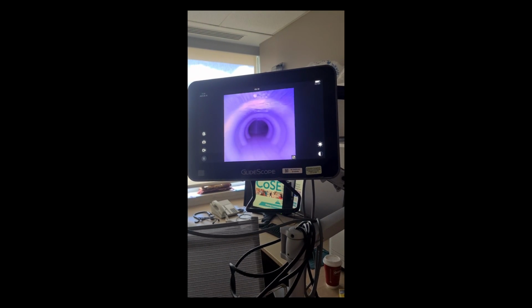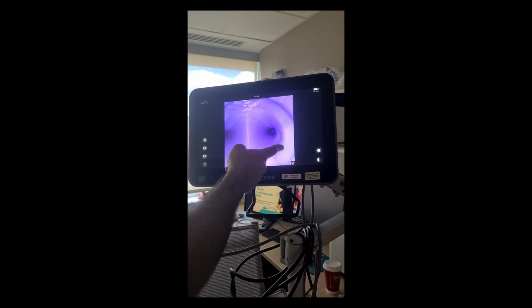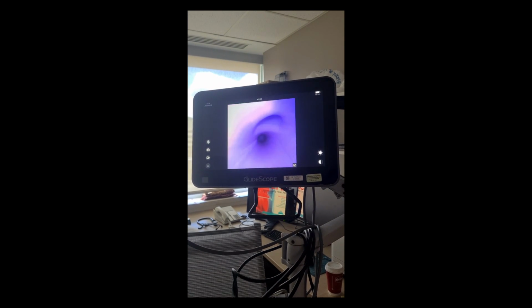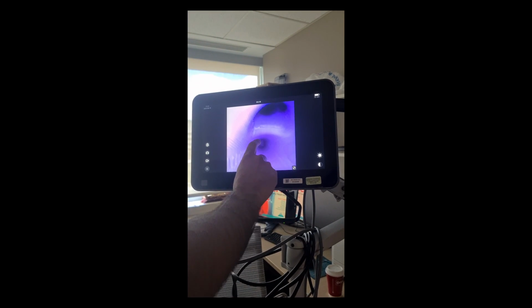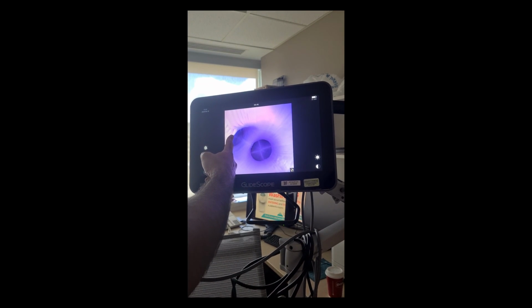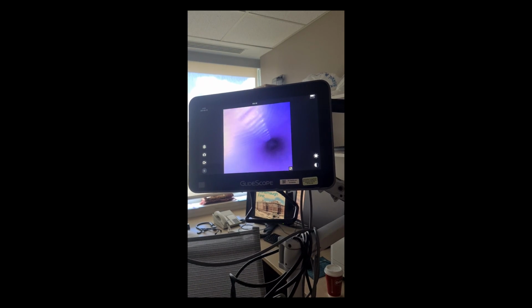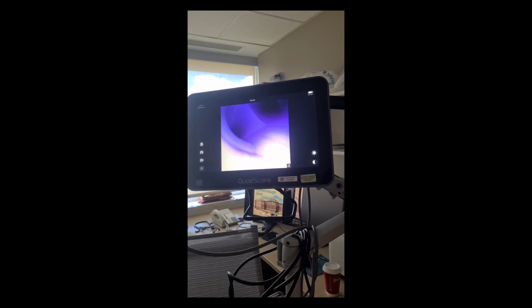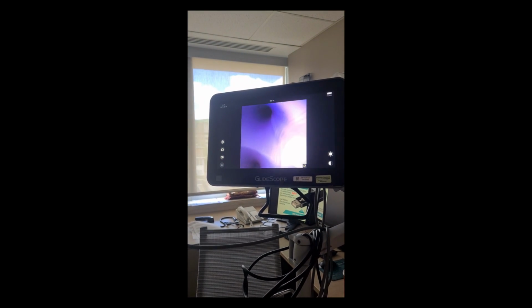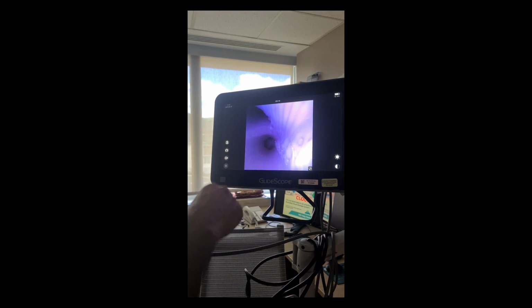As we go down, you can see the carina there, the right mainstem bronchus, the left mainstem bronchus. As you go into the right mainstem bronchus, you can see the right upper lobe take off, the right bronchus intermedius, and as you go down, that should be the right middle lobe and the right lower lobe. So it's a pretty good 3D printed model of actual lungs. Now we're back to the carina, and then we're going to go towards the left lung. That's the left upper lobe and the left lower lobe.